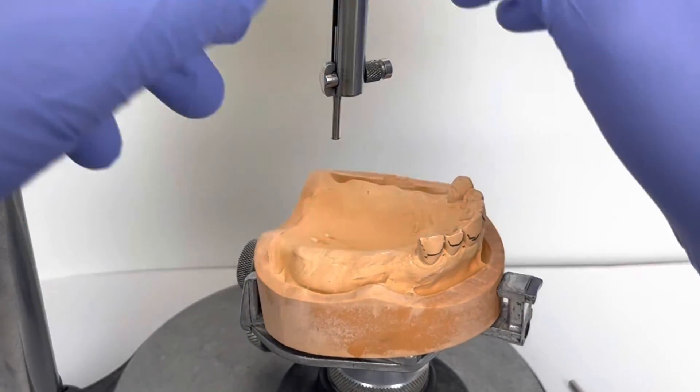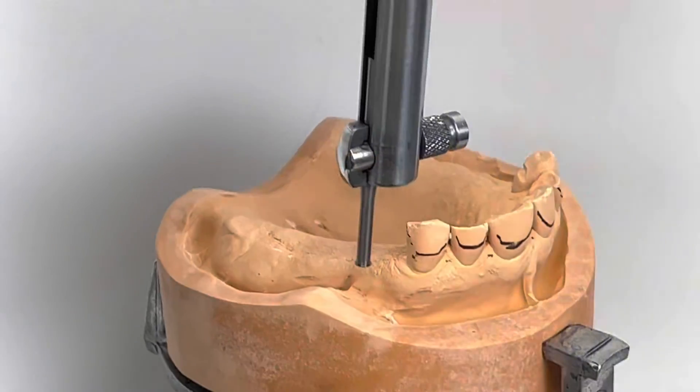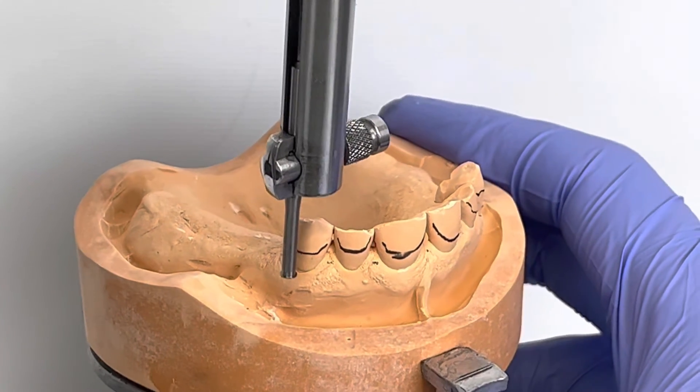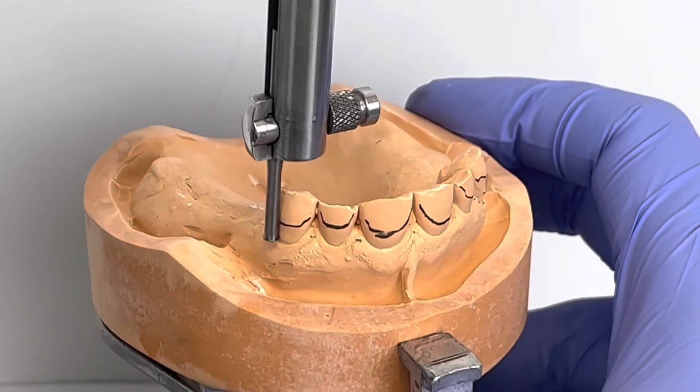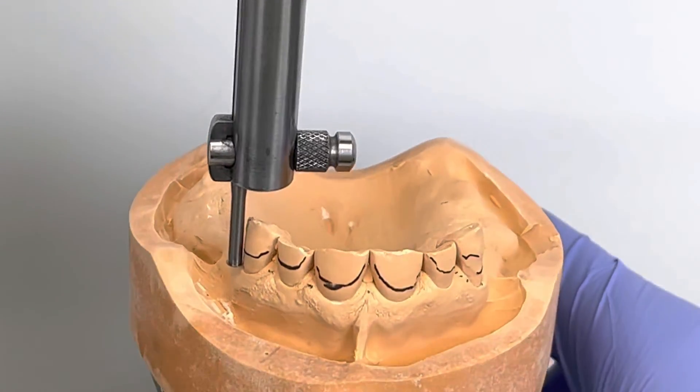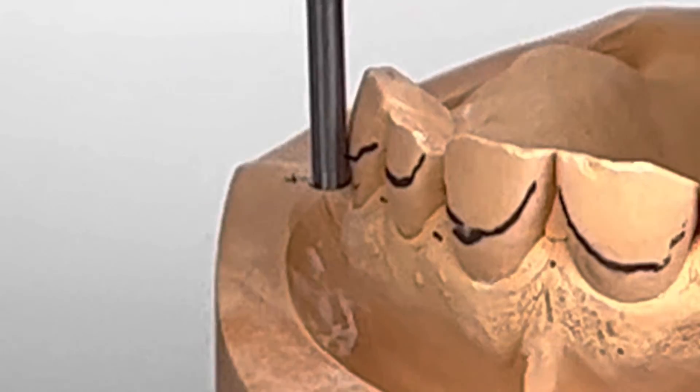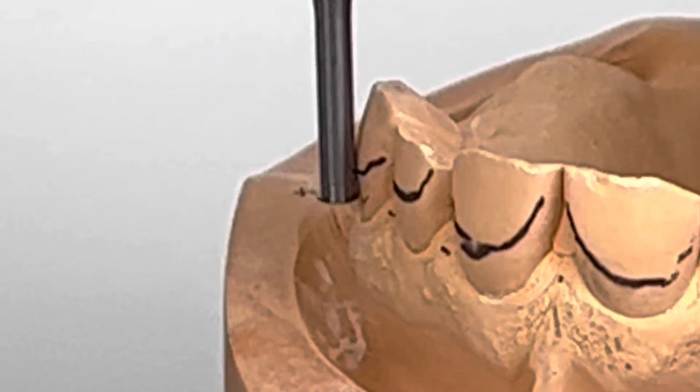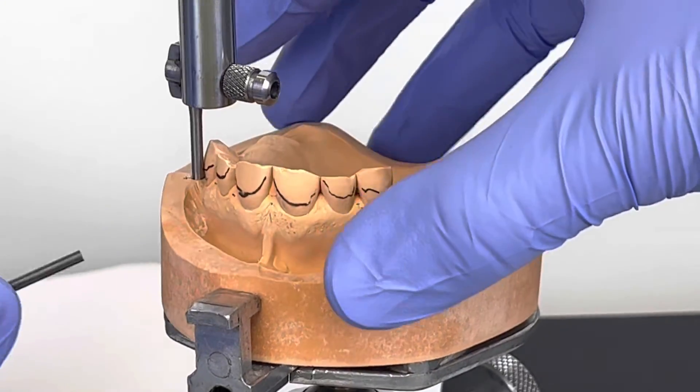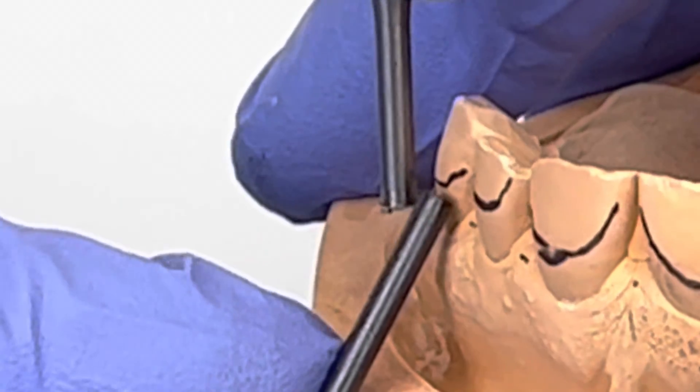It is placed within the mandrel. The undercut gauge is then positioned so that both the shank and the disc touch the teeth. The shank will inevitably touch the height of contour; wherever the disc touches is the indicated undercut. Those undercuts can then be marked with a lead marker to indicate the position of the undercut.